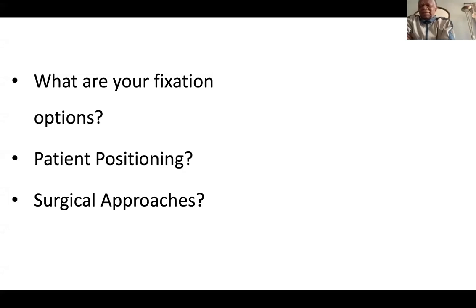For this particular patient, I'll use a standard locking nail, which has a trochanteric entry point, because a piriformis entry point nail would also, with the deforming forces, risk you having a varus deformity and not being able to attain a perfect reduction. So a trochanteric entry nail, using an entry point that is a bit medial but on the trochanteric side, will help with the reduction.